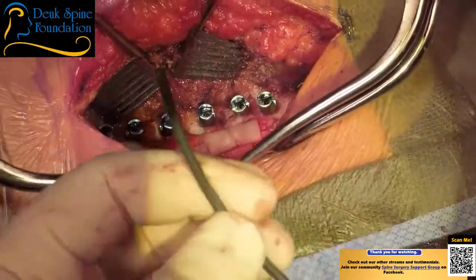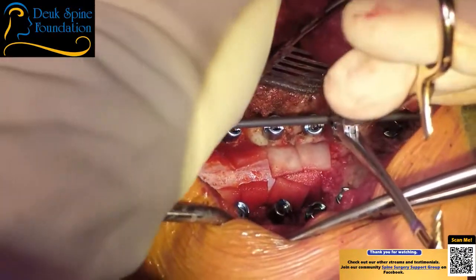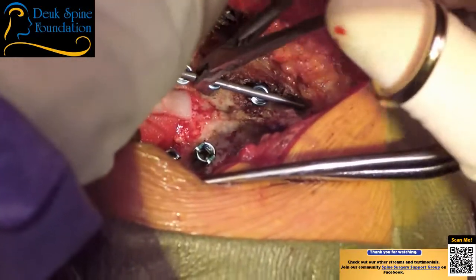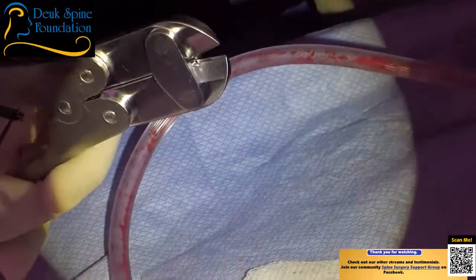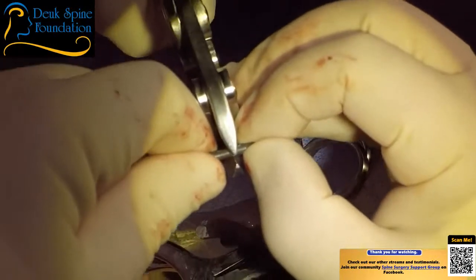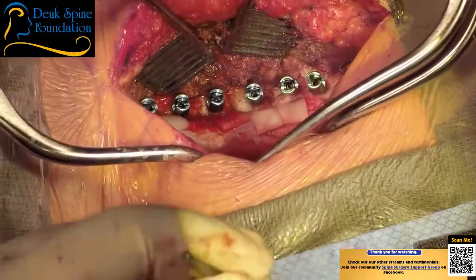All right. So we put a curve. Remember, we want the spine curved back, and we can only reduce her deformity. She didn't have that much scoliosis or kyphosis, but we are limited in how much deformity correction we can get because these patients are all pinned, okay? But we can get deformity correction after we get her out of the pin. If we contour the rod properly, then she can actually reduce her spine to the rod. And as long as we're happy with the rod contour, she'll get realigned after she gets out of the Mayfields, because the spine will reduce to the rod.